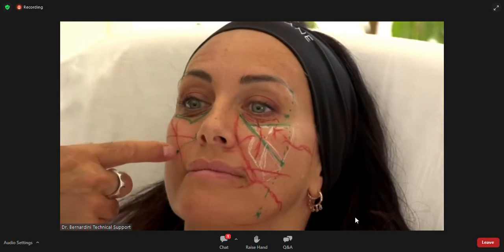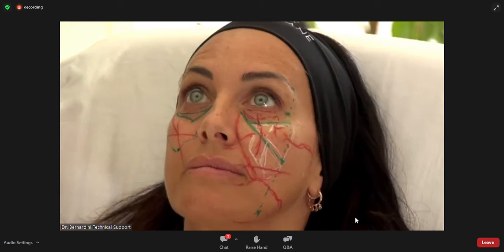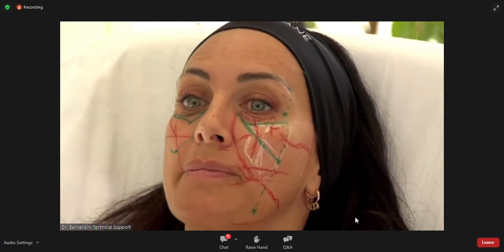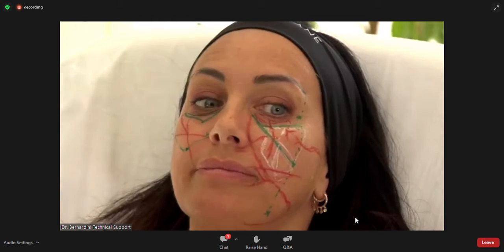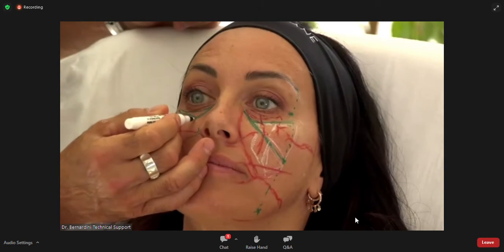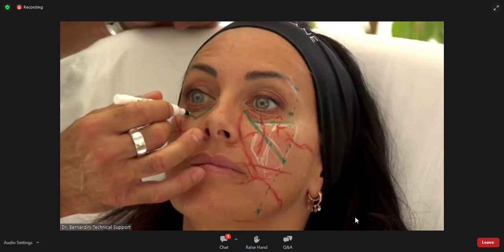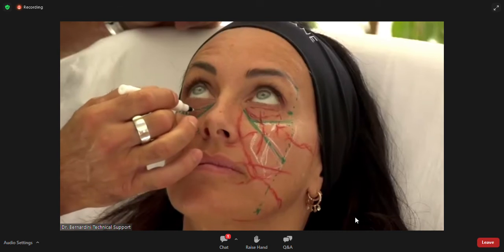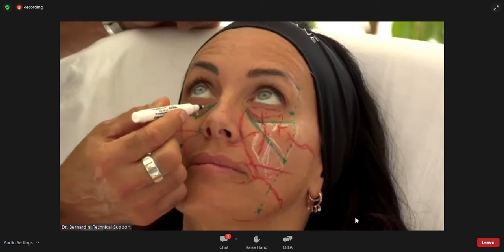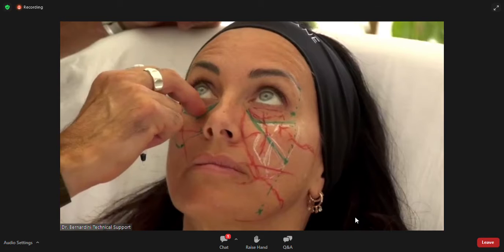So from this point here, I have access to all the areas of the infraorbital and eventually the teardrop, and the nasolabial. So in a patient like that, if I had to prepare for my injection, here would be a bolus, here would be a big bolus, then all across I will be planning on my half boluses. It will be all under the orbital rim, so not in the eyelid, well below the orbital rim.